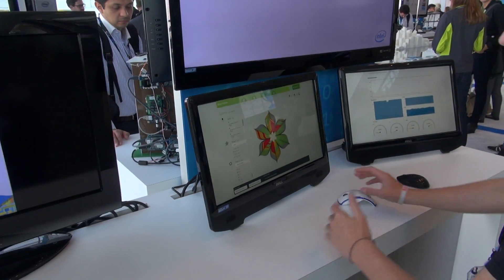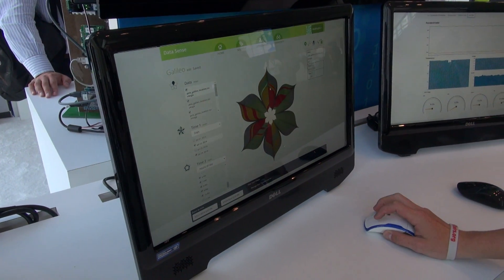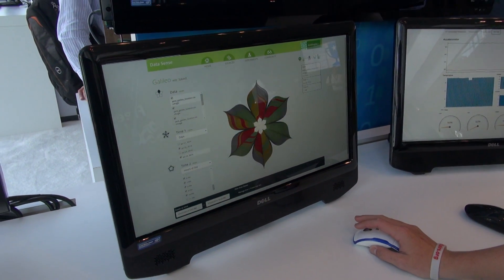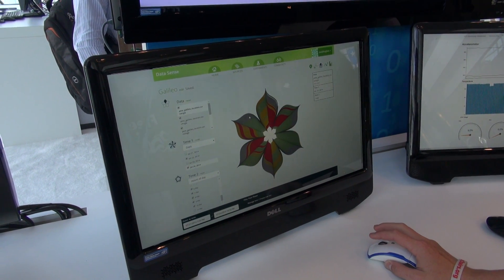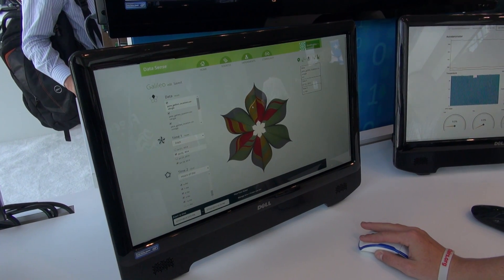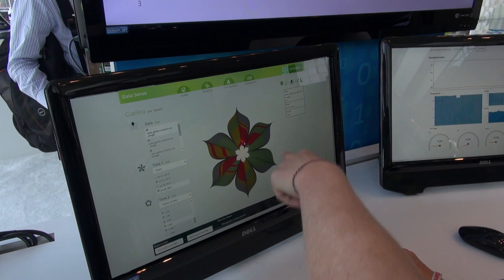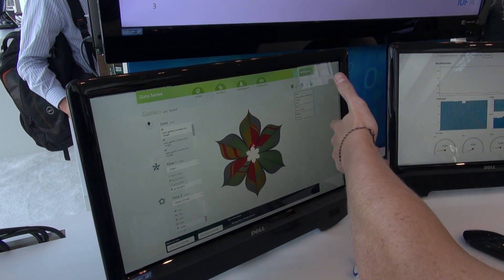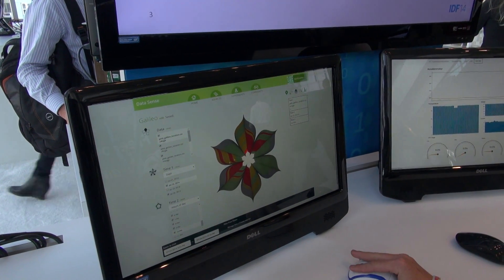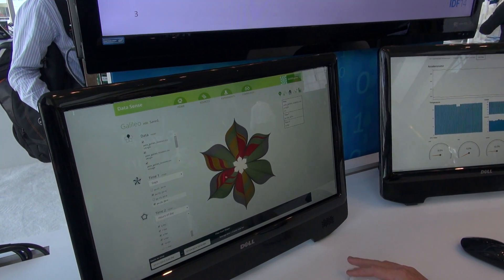This is what's called Data Sense, and it's used to show the meaning behind historical data. We have a mentor on the product named Pete Denman, who's actually a wheelchair user who created this. You can go back and see different data points — for example, looking at the red, my angle was different than normal, so I was probably going up a slope. I'm able to go back through my day and self-diagnose, becoming part of the quantified self movement.